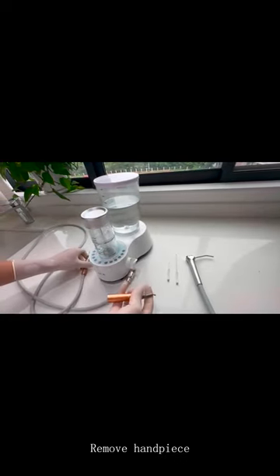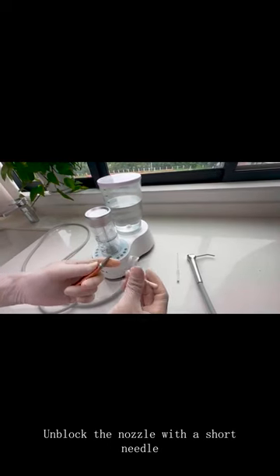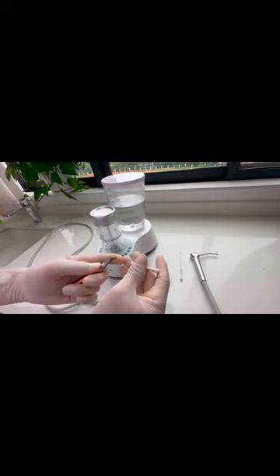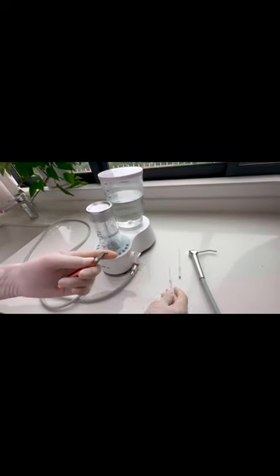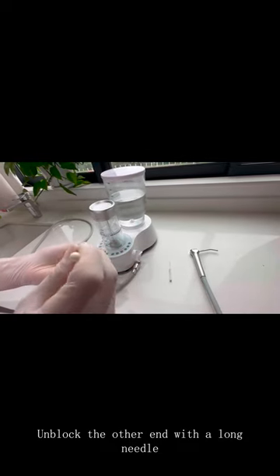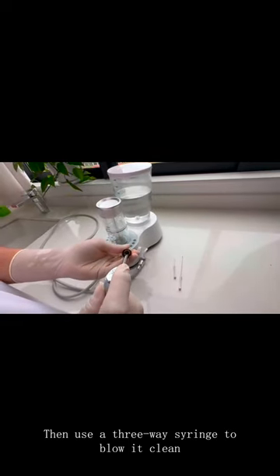Remove the handpiece. Unblock the nozzle with a short needle, and unblock the other end with a long needle. Then use the three-way syringe to blow it clean.